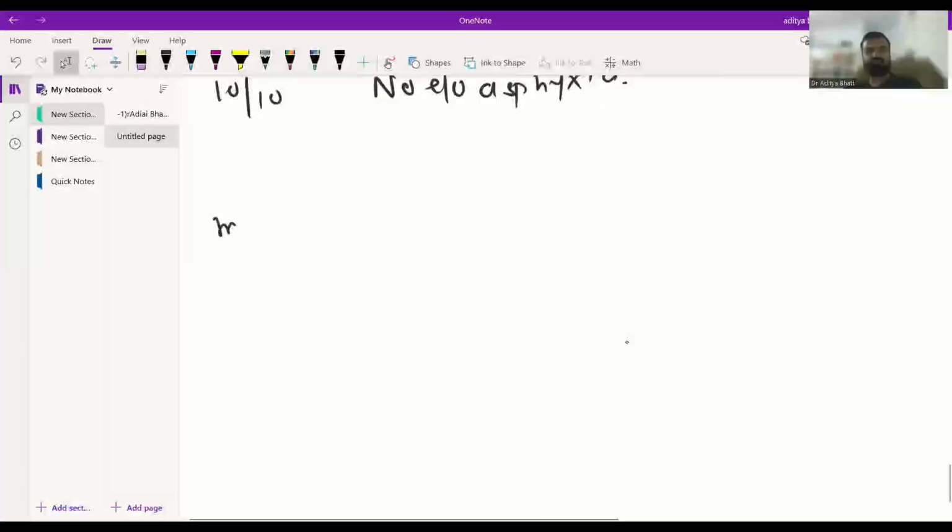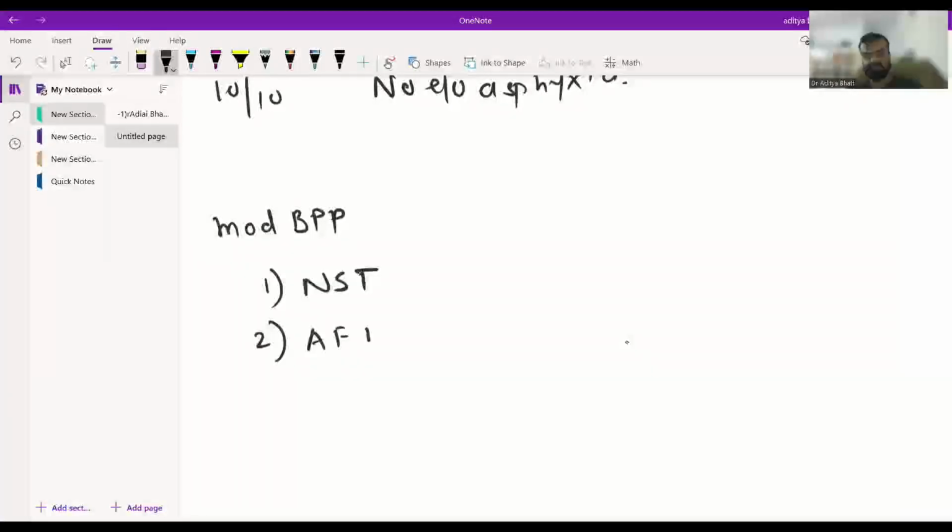Now, the modified biophysical profile is also created, which has only two things. It is NST and amniotic fluid index. Two things, NST and amniotic fluid index. Now, why these two were used: NST is suggestive of an acute insult.